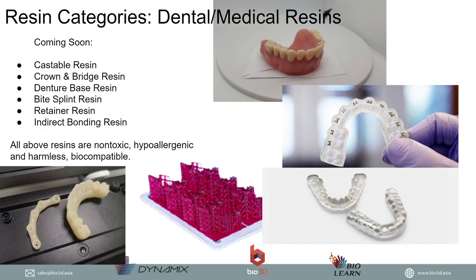So, for example, if you find that the retainer is deviating slightly and doesn't fit as well as it once used to, not a problem. You can put this retainer in a glass of warm to hot water, and it will go back to its original form.